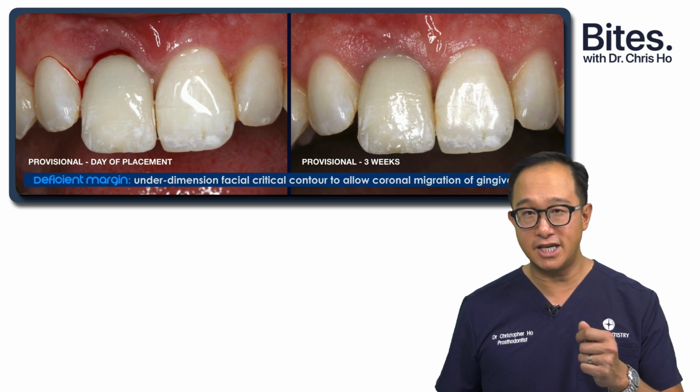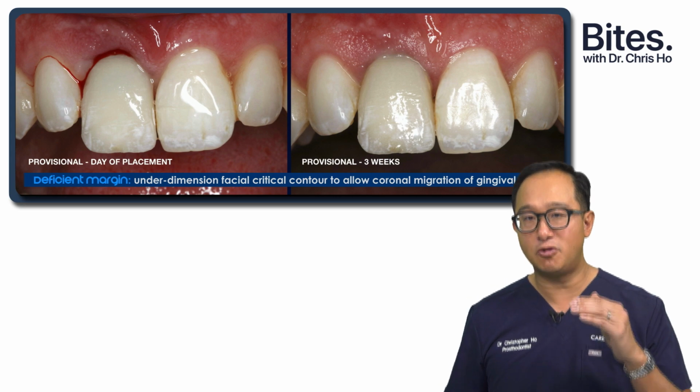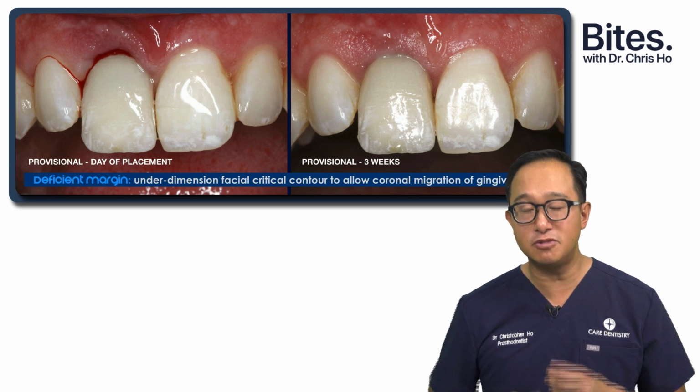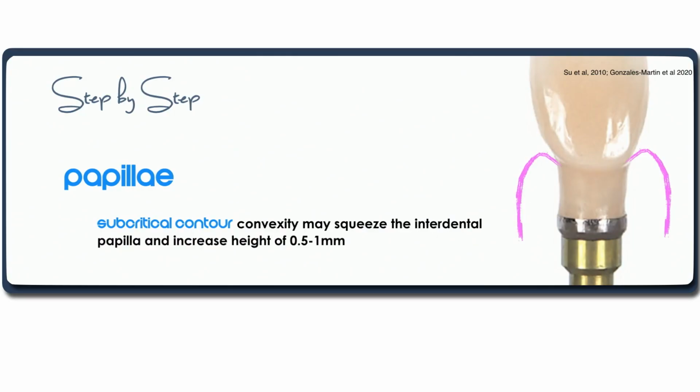Oftentimes when you place an implant, you've extracted the tooth, you place an implant, you'll see at least 0.6 to 1 millimeter of mid-labial gingival margin recession. So in this case, you can see some coronal migration by slightly under contouring the restoration. Now, what about the papilla? The papilla, we can even squeeze that papilla to attain a slight increase in height of the papilla, of 0.5 to 1 millimeter in height.